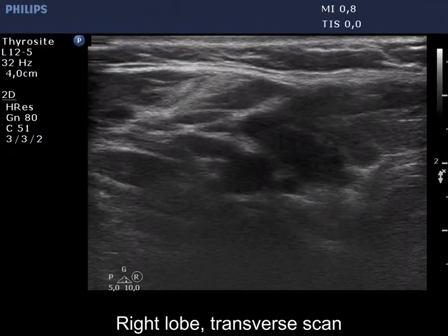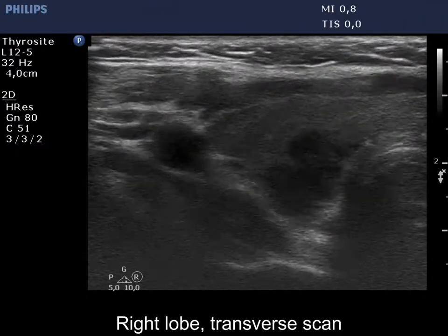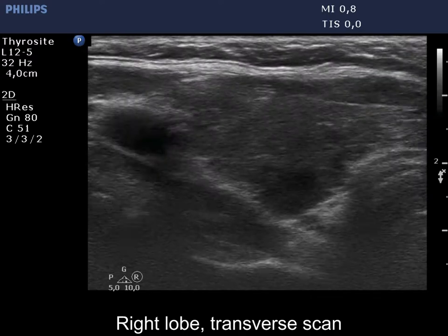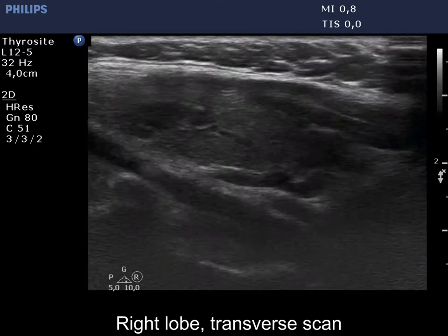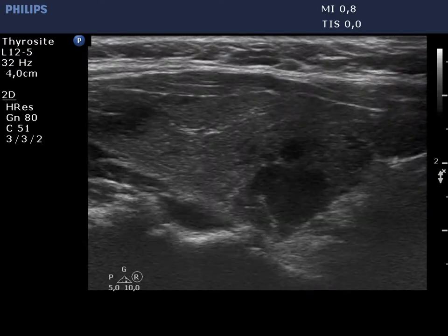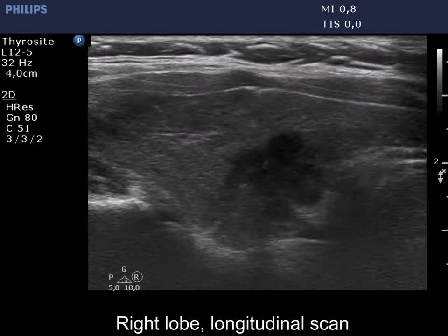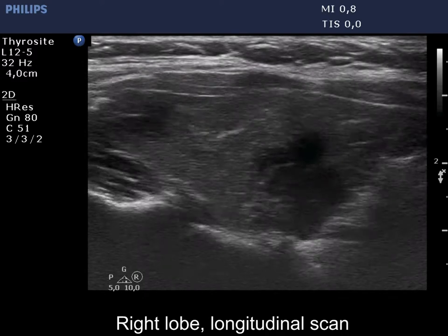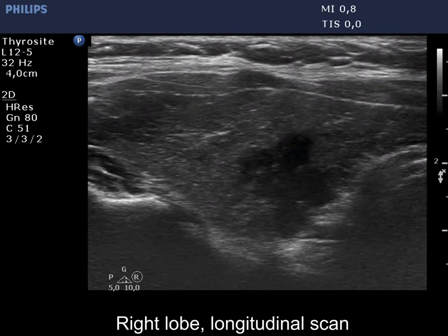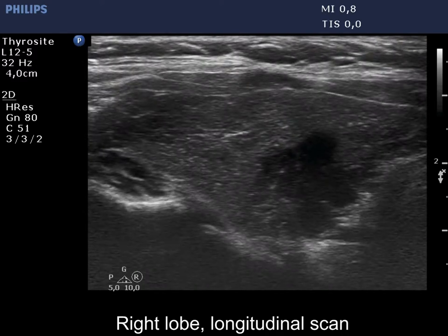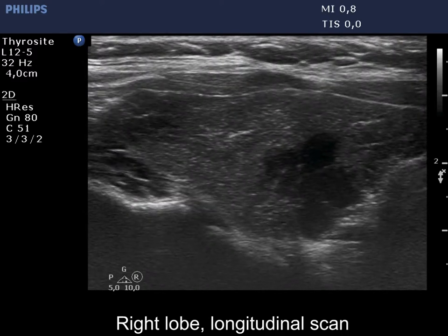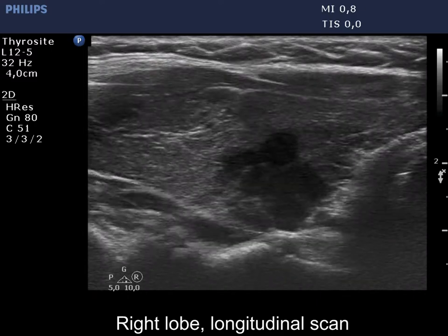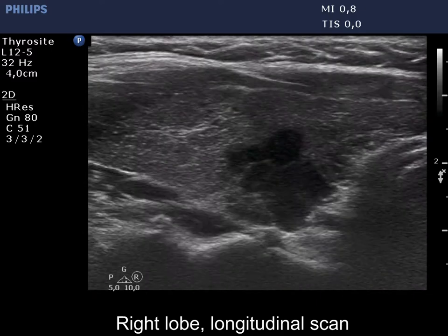The thyroid is moderately hypoechoic and has multiple deeply hypoechoic masses, one in the lower dorsal part. Although the mass has a lobulated surface, this undulation is caused by the presence of multiple discrete lesions next to each other.